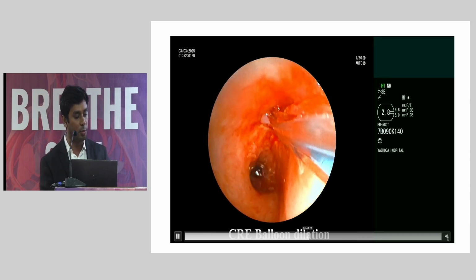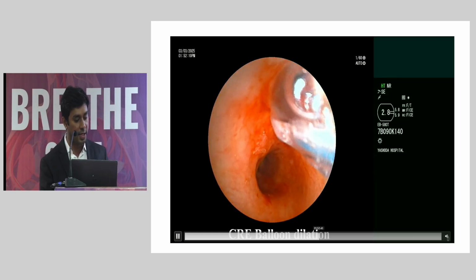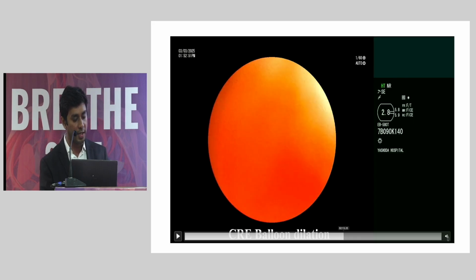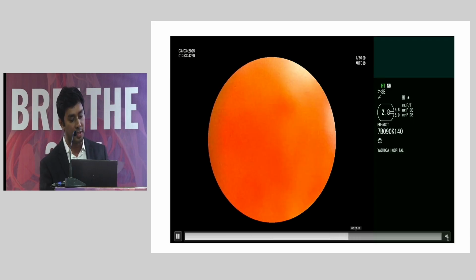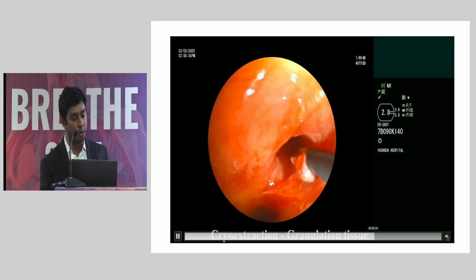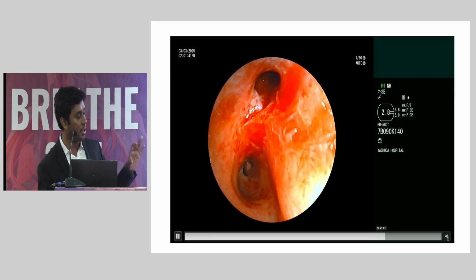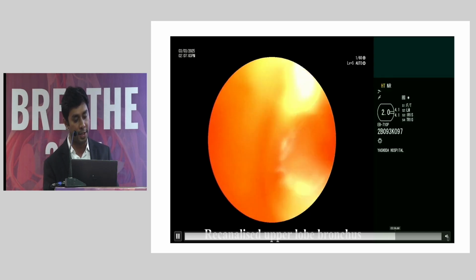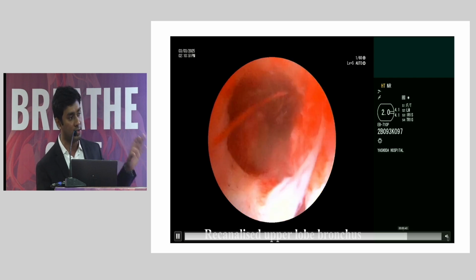Now you can see that once I have opened up a little portion of the right upper lobe, I am passing the CRE balloon and dilating with the help of the CRE balloon. And once the CRE balloon is dilated, you will see that the pus which has collected distally is exuding, and I am later removing all the granulation tissue with the help of the cryoprobe. And now you can see a right upper lobe which was not there has become almost completely recanalized, the right upper lobe is saved, and we are even able to see the distal subsegments.